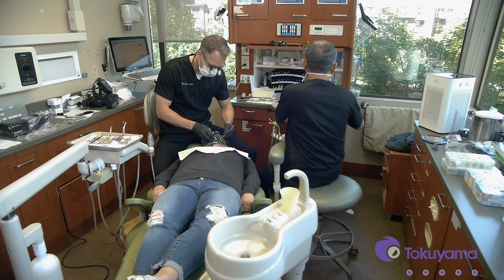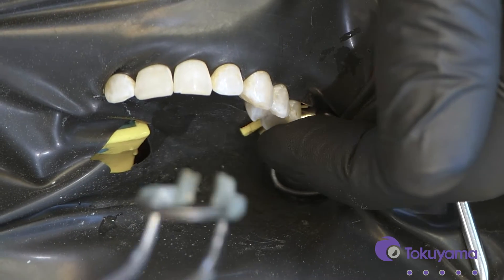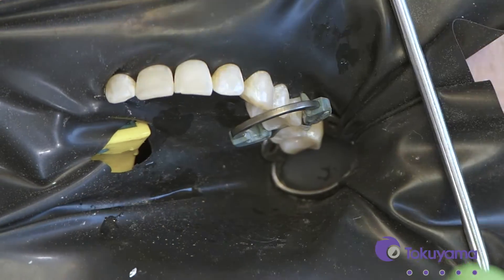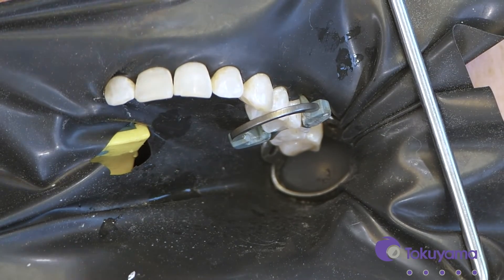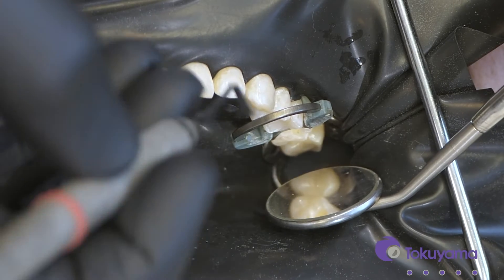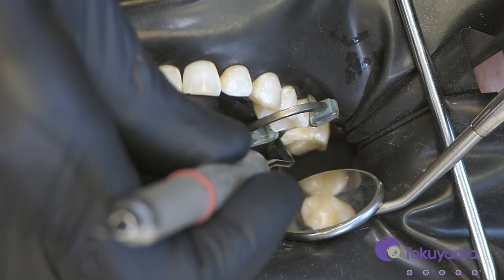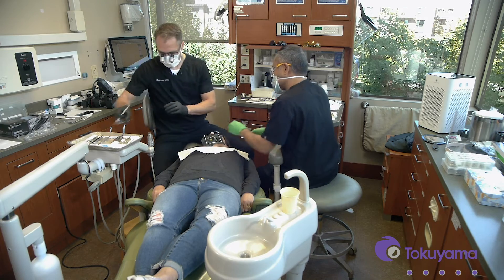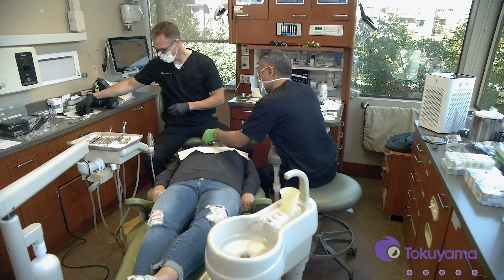And then our wedge. There we go. We've got a nice seal.